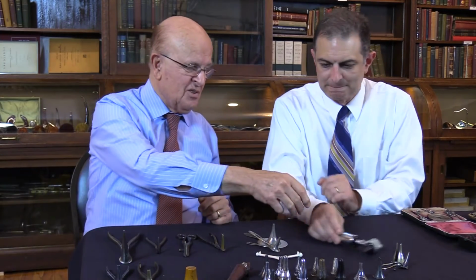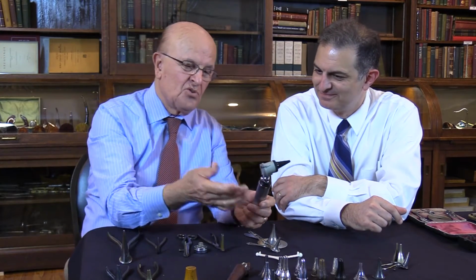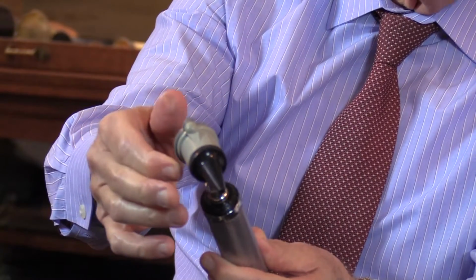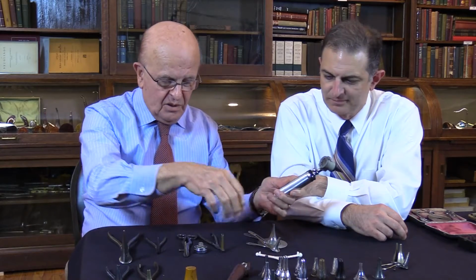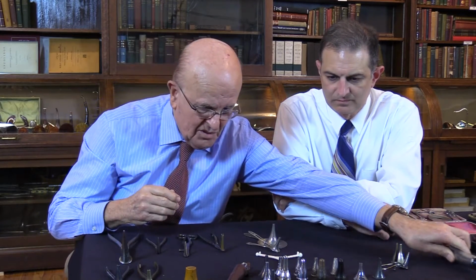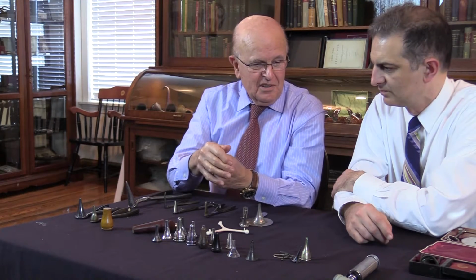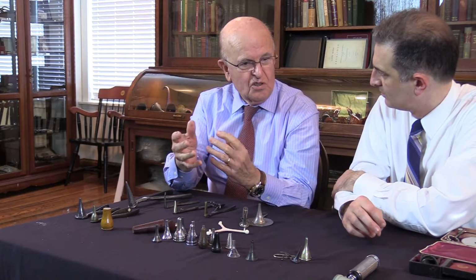Well, if you look at this, Joe, the main components of an otoscope are the ear speculum, lighting, and magnification. And to get to this point, it took about 300 years. So as you can see, they started with the ear speculums, which is the first thing that they had to solve. In the 18th and 19th centuries, all the otologists and otolaryngologists were competing with each other. Who's going to name an ear speculum after his name?